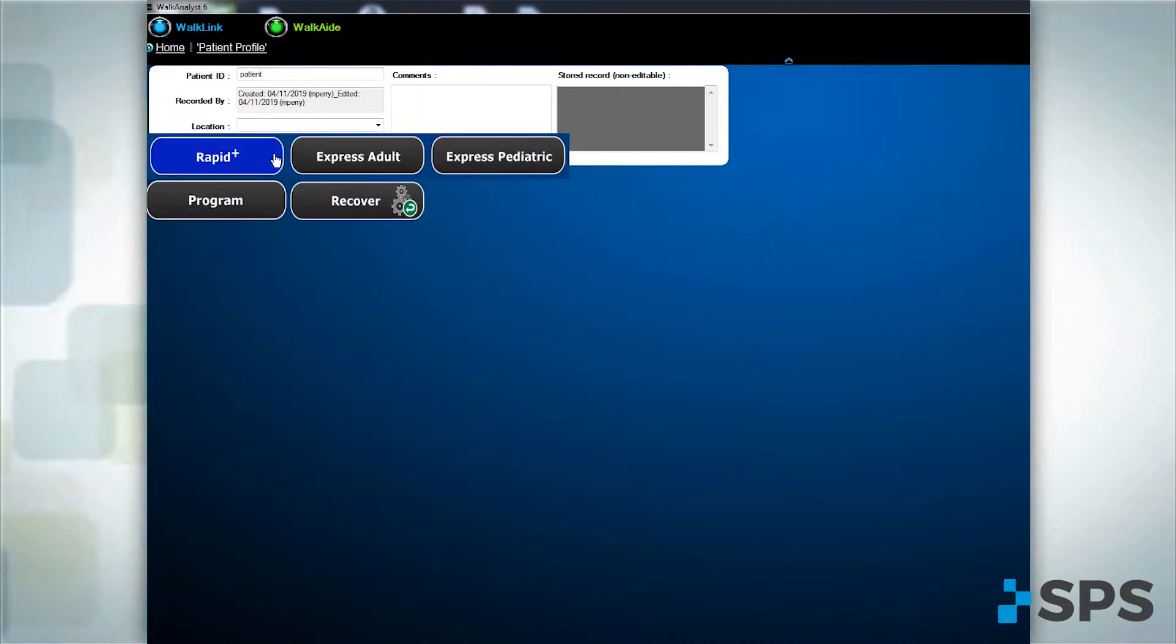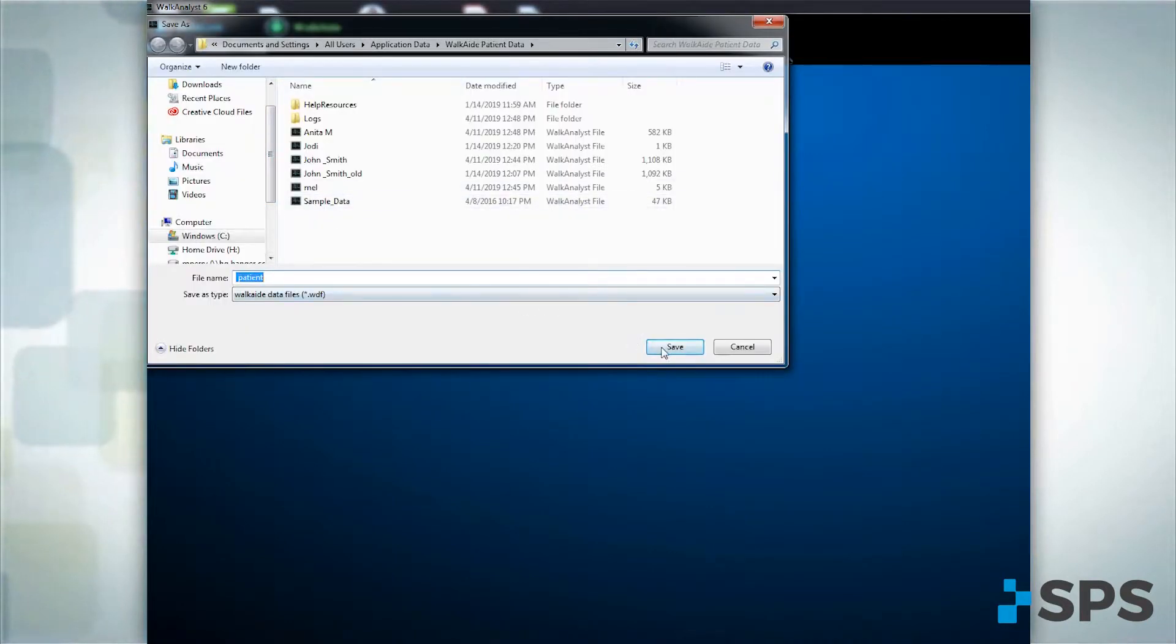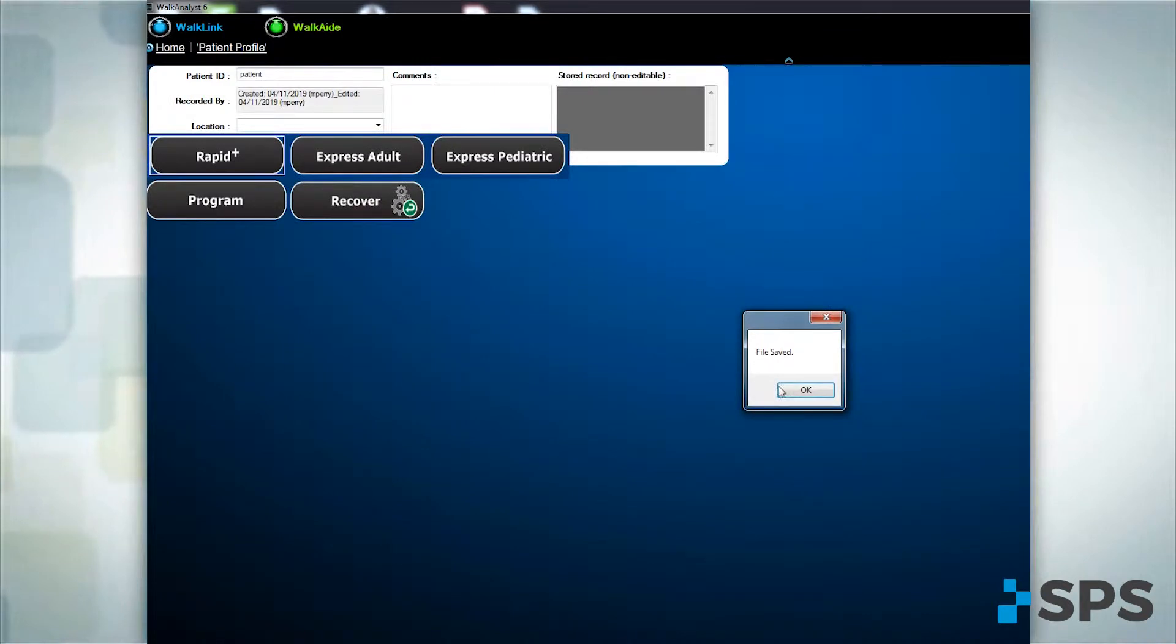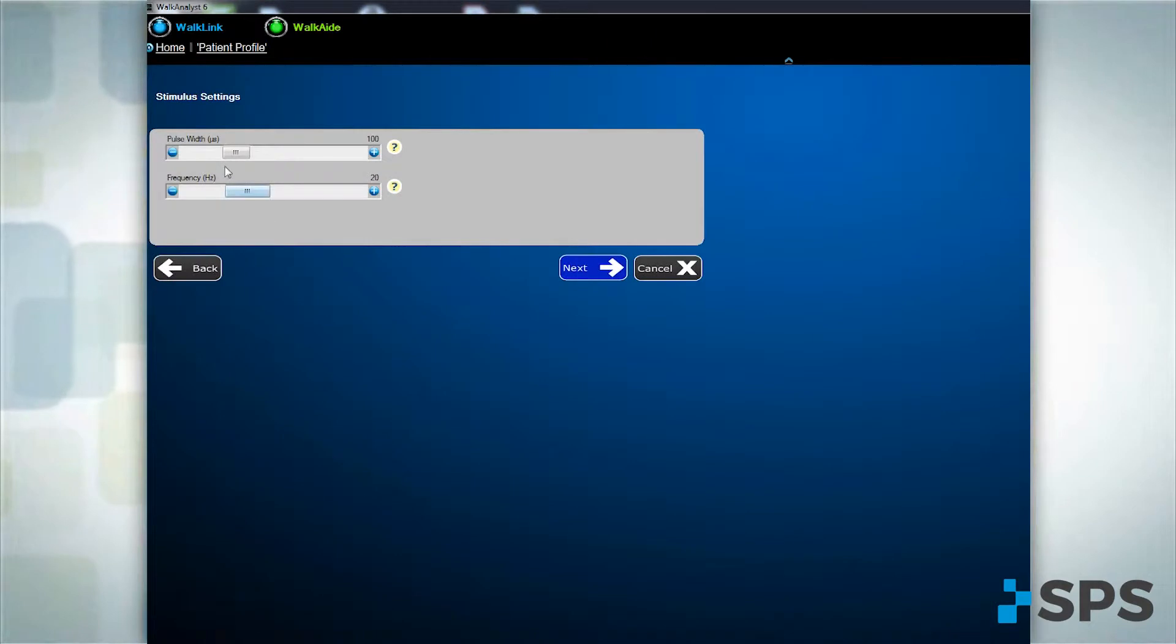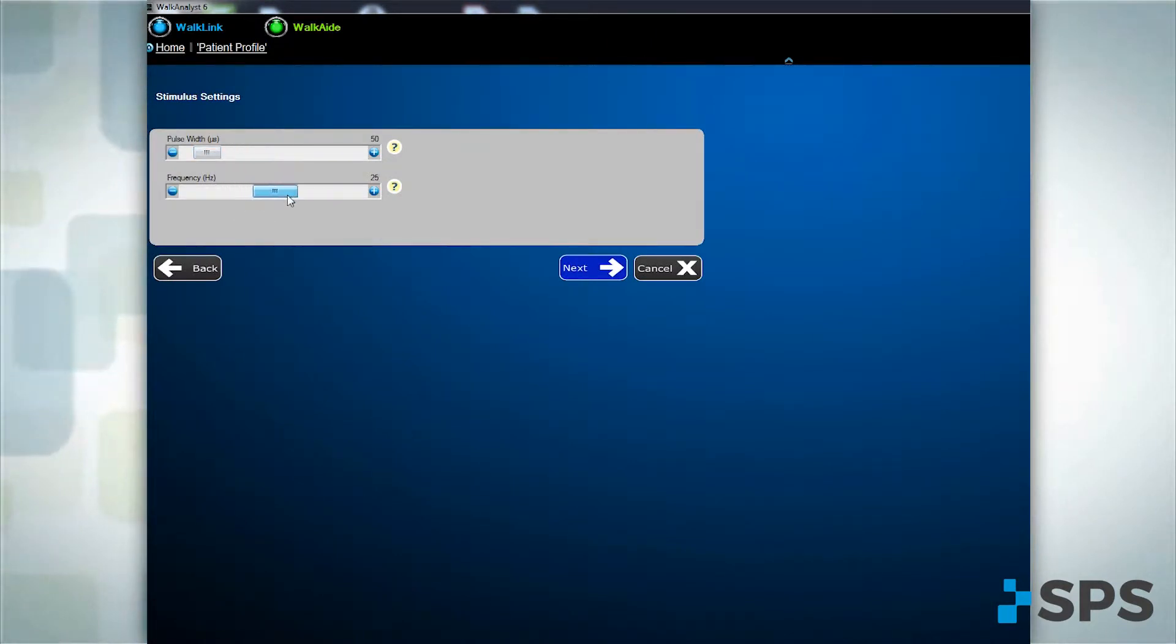Confirm the location where the file will be saved and click save. The WalkAid system is now ready for data collection. In the stimulus setting window, you have the ability to adjust stimulation parameters. You are now ready for walking data collection.